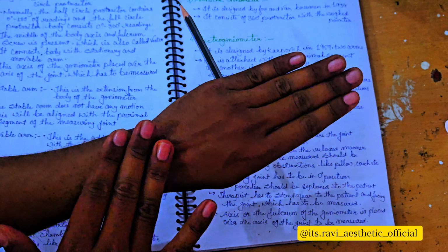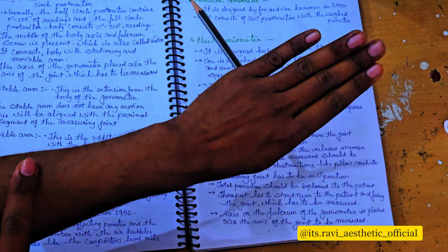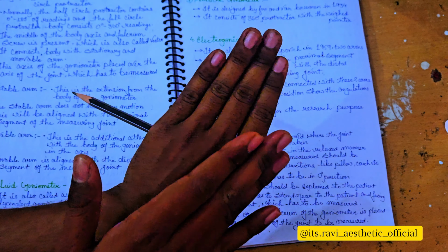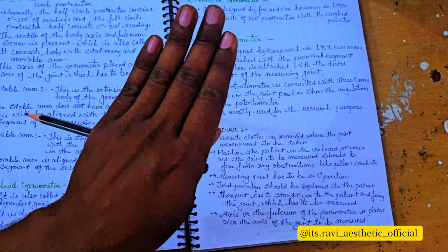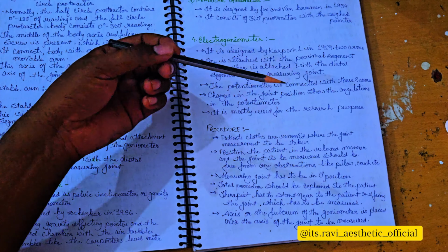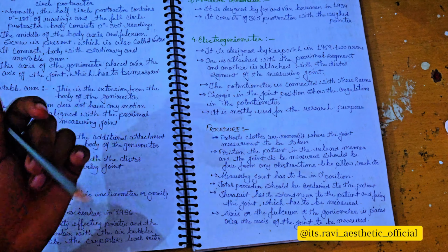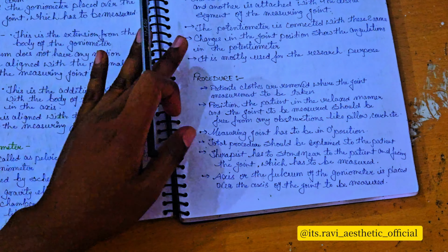So I'll put it here, the movable arm at the third metacarpal joint and the stationary arm at the interosseous membrane between the radius and ulna. When you move the movable arm, it can digitally show how many degrees of movement occur in the joint. So that is the electrogoniometer. It is mostly used for research purposes. If there are lots of contractures developing in the body, it can be used for research. So now we come to the procedure of the goniometer, which you can write in the university examination for good marks.